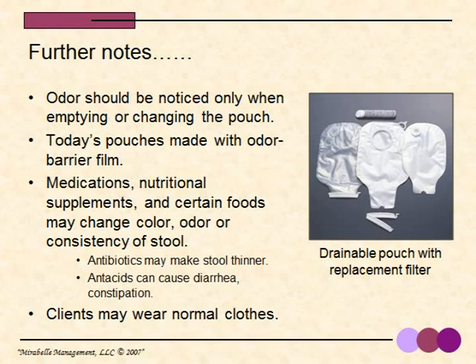And speaking of diarrhea and constipation, these conditions can affect an ostomy client just as much after the ostomy as they may have before the ostomy. Clients with colostomy should be able to wear normal clothes. Today's pouches are low profile and fit so close to the body that chances are no one will know if someone is wearing a pouch or not.